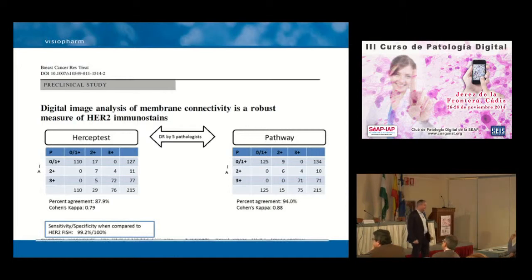They're quite high, and what it means is that pathologists are actually very, very good at reading this. But still, they could not achieve the same sensitivity and specificity with respect to the gene amplification. And this is not just a cognitive issue. It's also because pathologists, sometimes that's what we hear, I'm not a pathologist, but pathologists tell us that sometimes we are in doubt and we want to give this patient an extra chance.